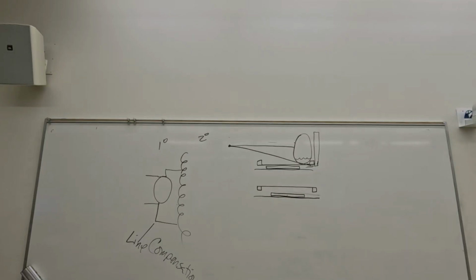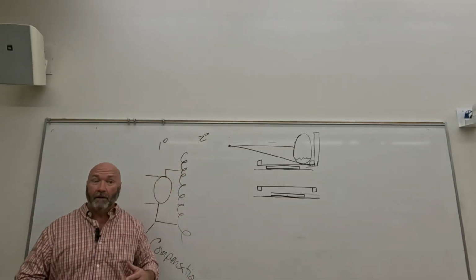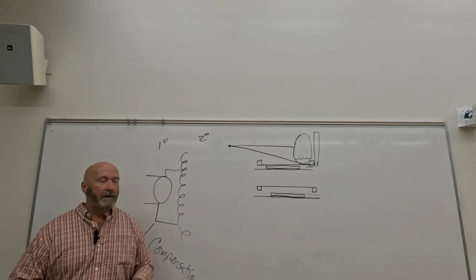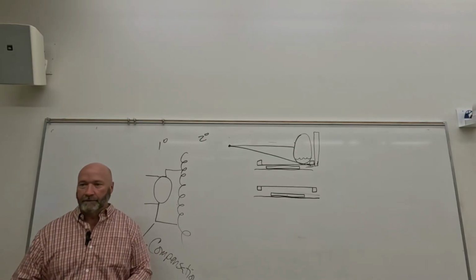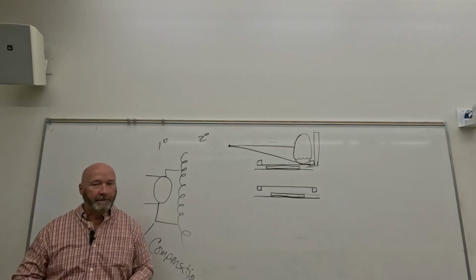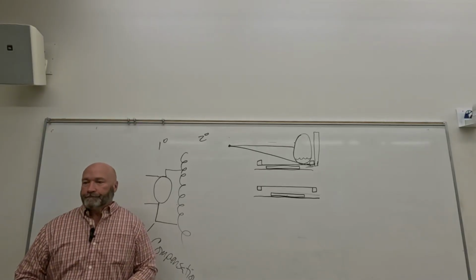All right, so all your X-ray rooms are shielded against radiation. The doors and the windows are going to be leaded glass. The walls you can't tell, but they are. When we had our lab replaced, they didn't get into the walls, so there wasn't any real need to, but they can go around to the rooms around them and check for leakage radiation. If they had disrupted any of the walls, they would have had to do that.